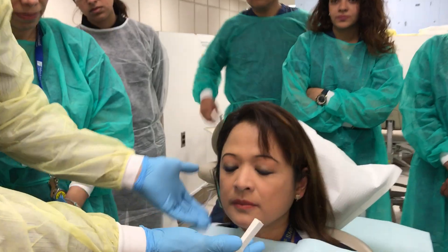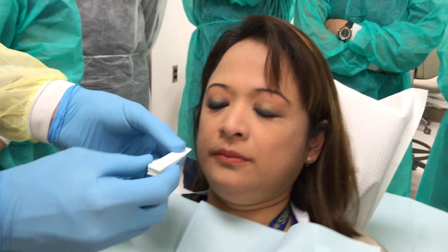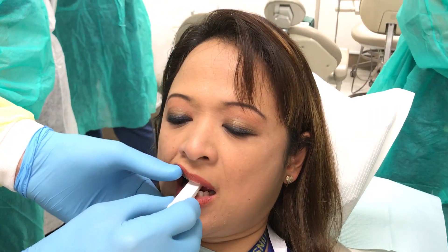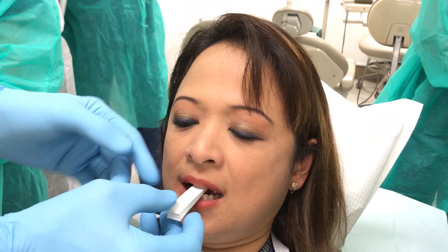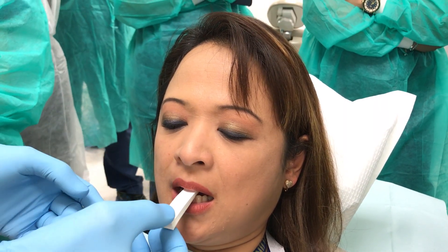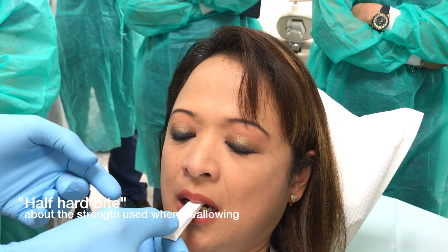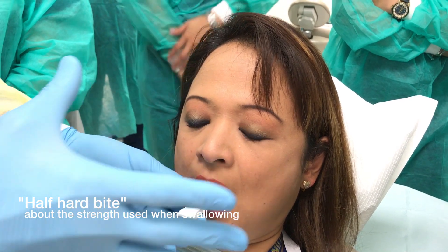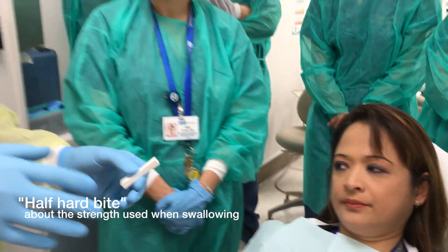Tina, I'm going to go ahead and have you just relax back on the headrest there and get comfortable. We're going to have you open for us and just place your teeth together on top of that pad. If you don't mind just moving your jaw forward just a little bit and then move it back. And then give me about a half hard bite — a bite that would keep me from being able to pull these out. Open for us. So that's essentially what we're going to be doing.